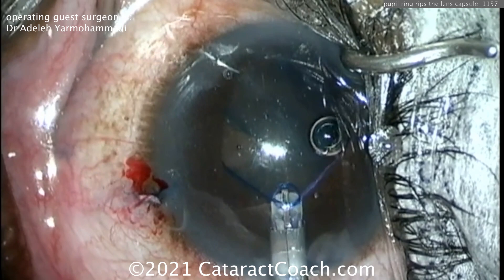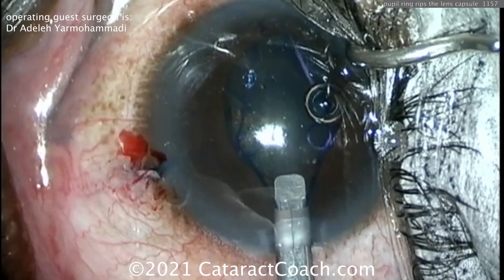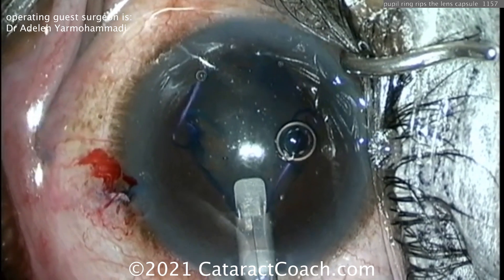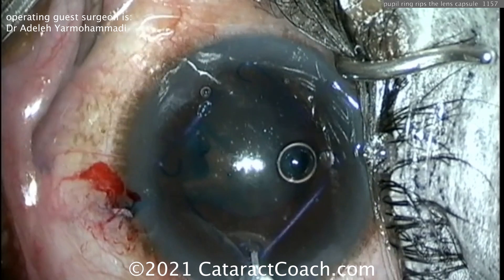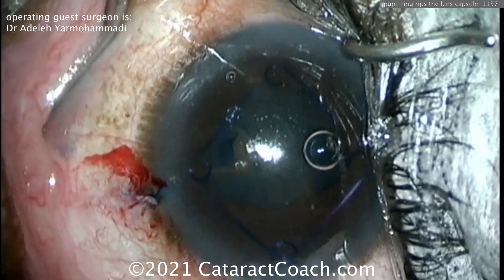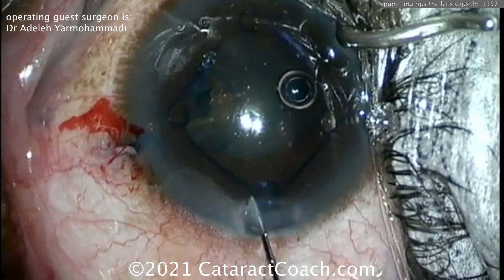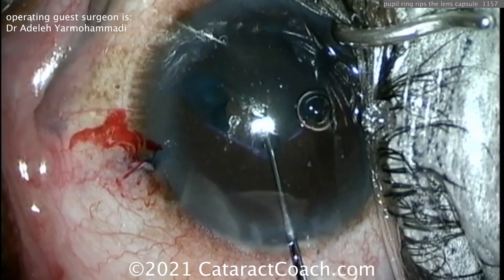Let's watch this doctor show us how to rescue this case. She's going to reposition the ring rather than remove it entirely — I like that idea. Get that ring in position and let's see the extent of the damage. Hopefully you can encompass that rip into your capsulorrhexis, perhaps making the rhexis a little irregular in that quarter, but as long as it's continuous and curvilinear without weak edges, you should be okay.